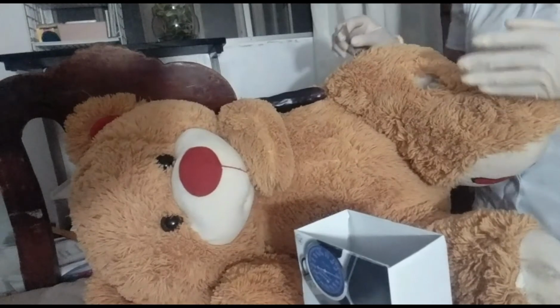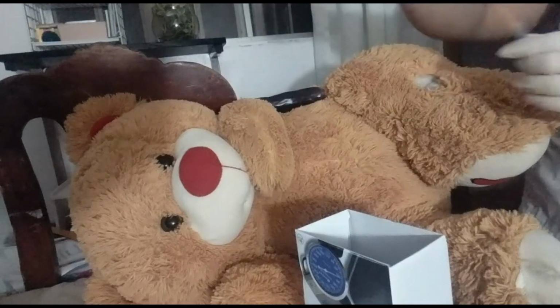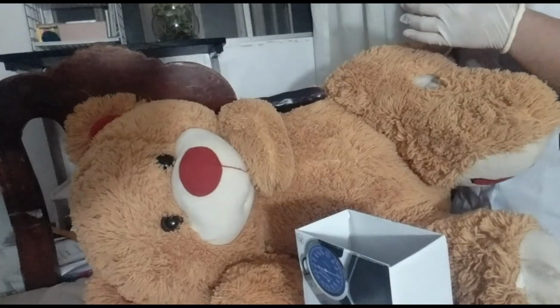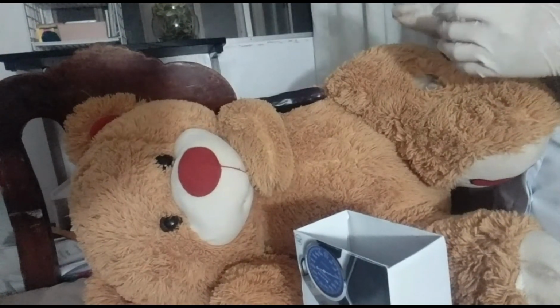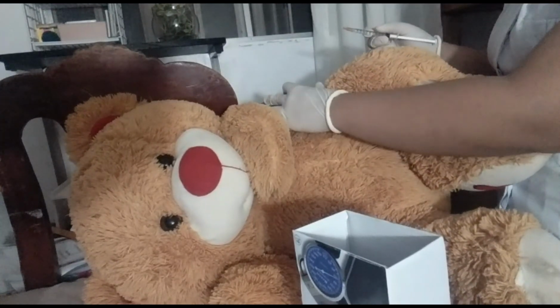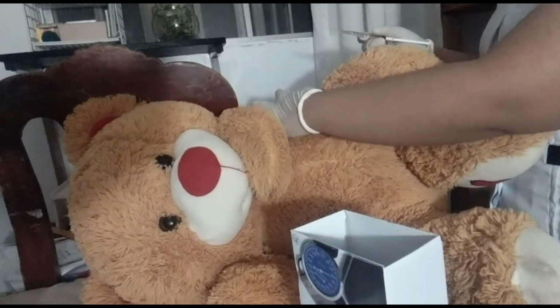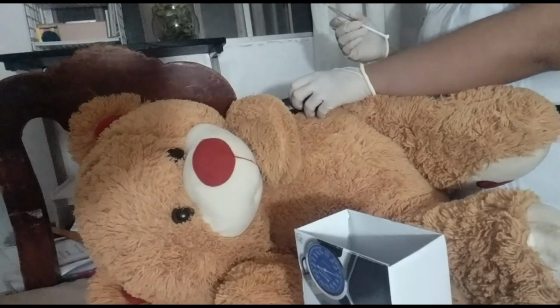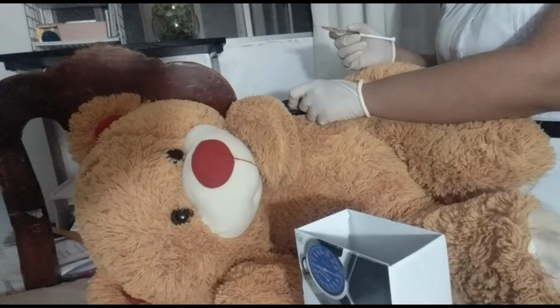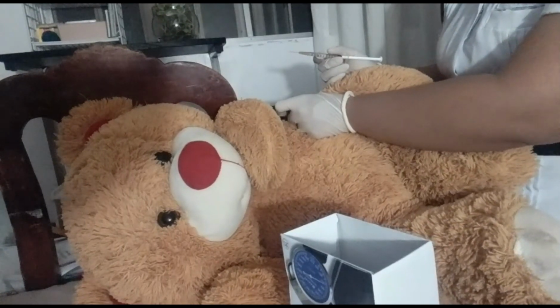In preparing the syringe, I will remove the needle cover and discard it without contaminating the needle. I will inject the medication using the Z-track technique, using the ulnar side of my non-dominant hand to pull the skin approximately 2.5 centimeters to the side. Under some circumstances, such as for an emaciated client or an infant, the muscle may be pinched.